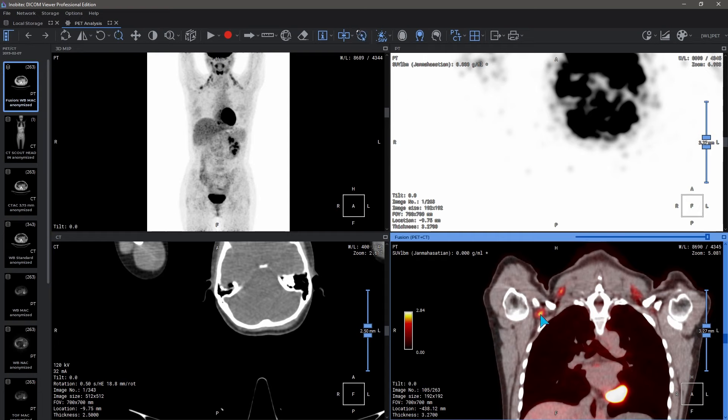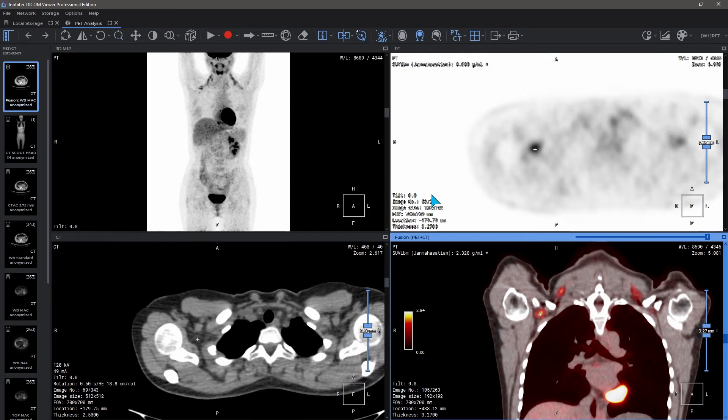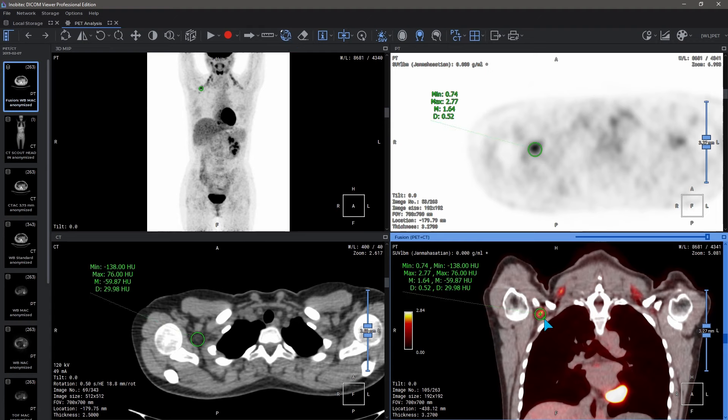By using the VOI sphere, you can find out the average intensity and standard deviation for a specific area. You can see the following parameters of the selected area: Minimum, Maximum, and Average Intensity Values.